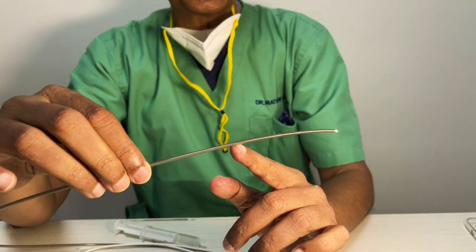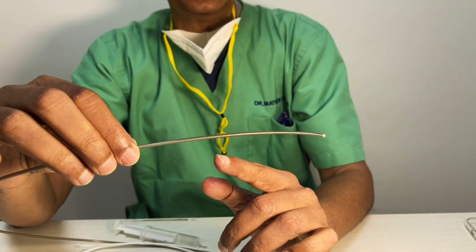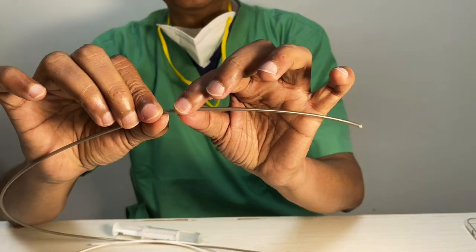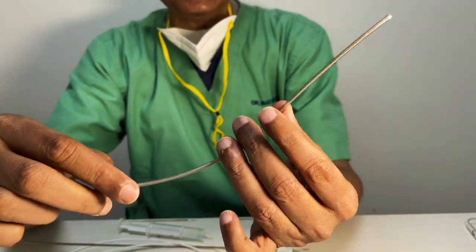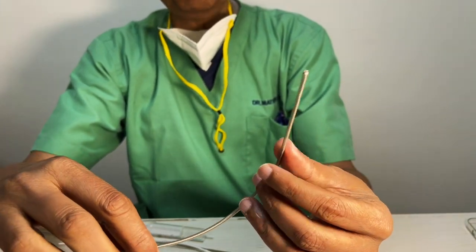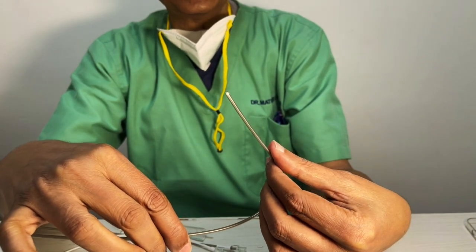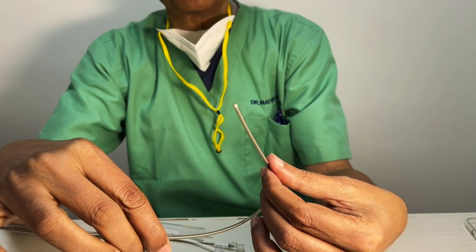But if you're going to work on stroke, for that matter, where you want to drive your suction catheter much deeper, you go for 90 centimeters. And this is the steel braiding. This is really stiff. This is 80 centimeters. So you know that theoretically this doesn't need a long sheath, but we still use it because this stiff end is going to sit right inside the arch and the carotid. But the reason we use it is that if by some chance it kicks out, it's not safe.